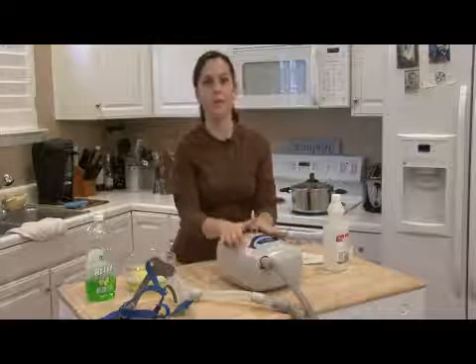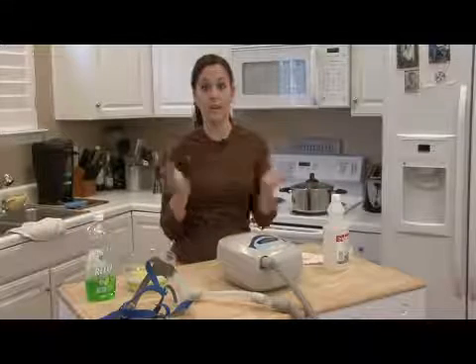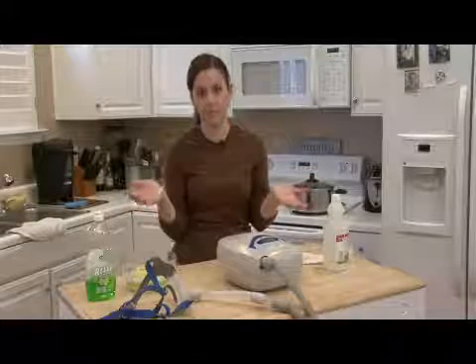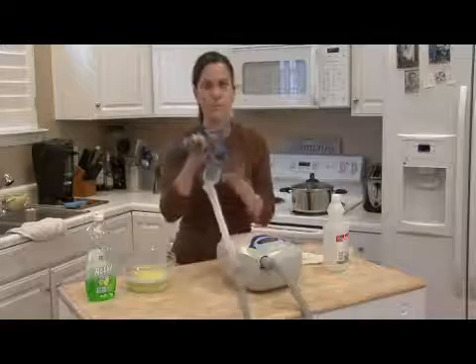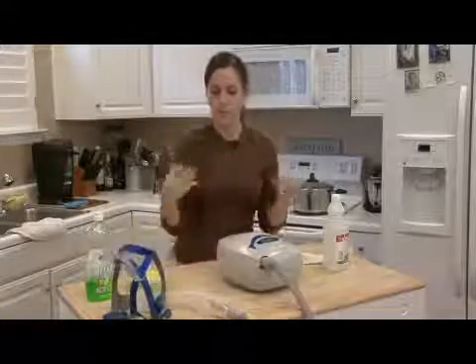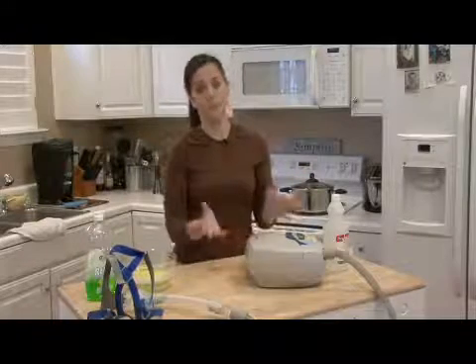It's for people who have sleep apnea, or maybe who don't breathe so well at night, or don't get good sleep. Really, a lot of people who wake up several times a night, it's because they don't get good sleep. What you need is one of these. It comes with a little mask that fits over your nose and your mouth so you can breathe well. And obviously, if you're going to be breathing through this thing, you want to clean it.